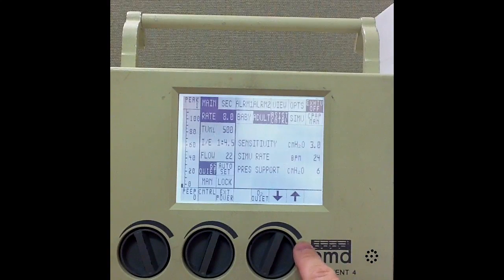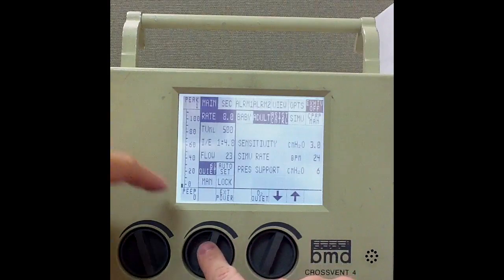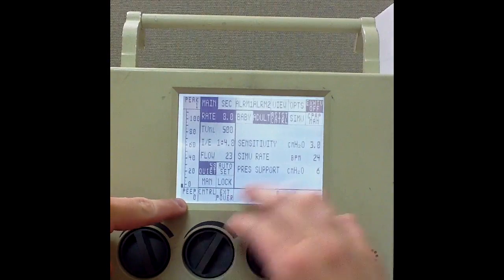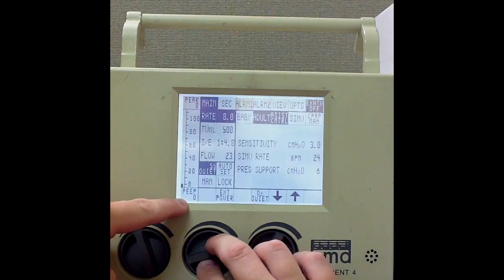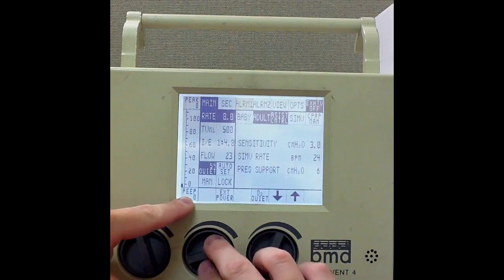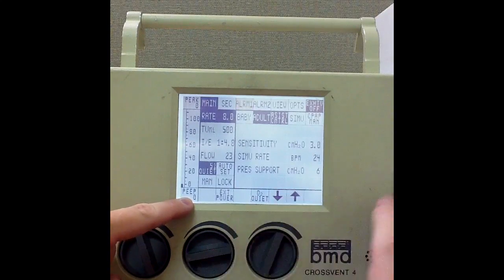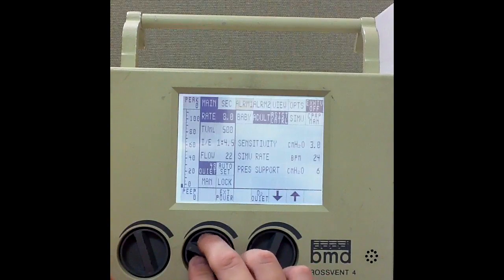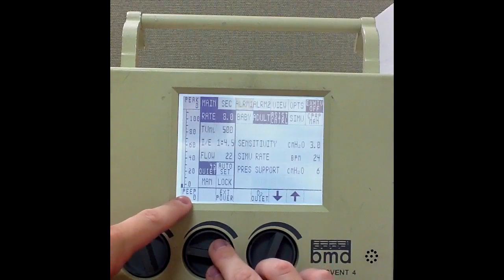I want my PEEP to be plus 5 centimeters. Down here I'll go ahead and increase my PEEP. Obviously it's not going to give me anything other than zero because I don't have any gas hooked up to the ventilator, but this is how I would increase the PEEP. We'll just say that I've increased it and I've got 5 of PEEP here now.